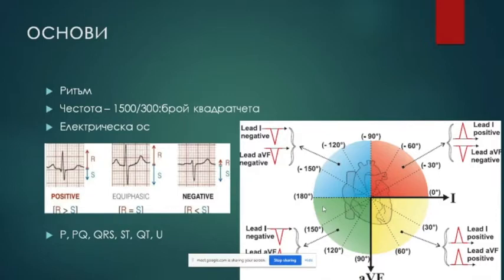So whenever you see an ECG, there are three things you have to discuss first and foremost, and then if there is any other pathology, you have to mention it as well. So what's the first thing you need to say when you read an ECG, to define?